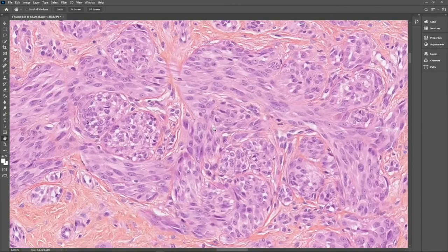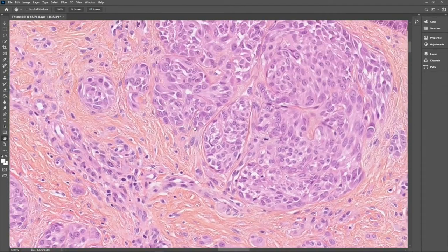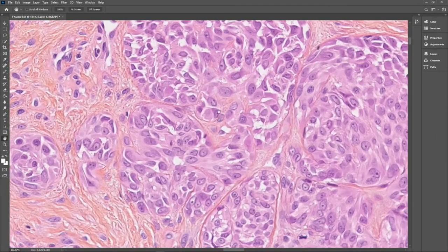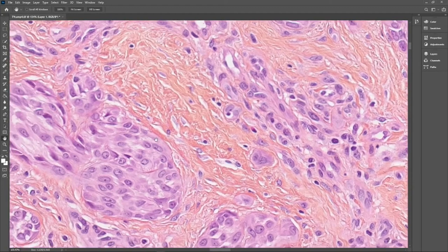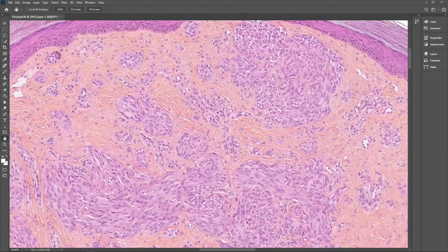The cells are large. They are spindled with eosinophilic cytoplasm. There are a few mitotic figures here and there. The nuclei are not very chromatic. There is often a small nucleolus. There is no real pleomorphism of these cells. Within the fibrotic background, we see multiple blood vessels with dilated lumen.